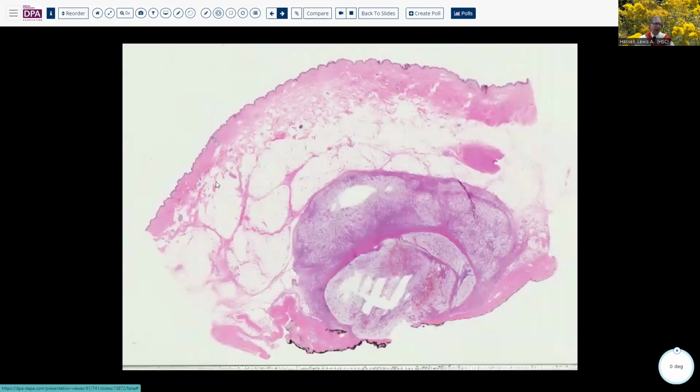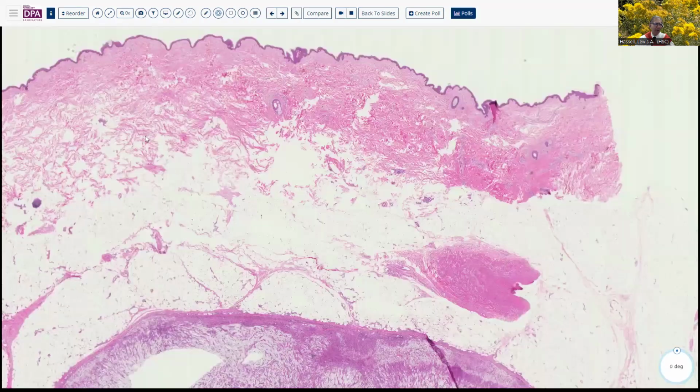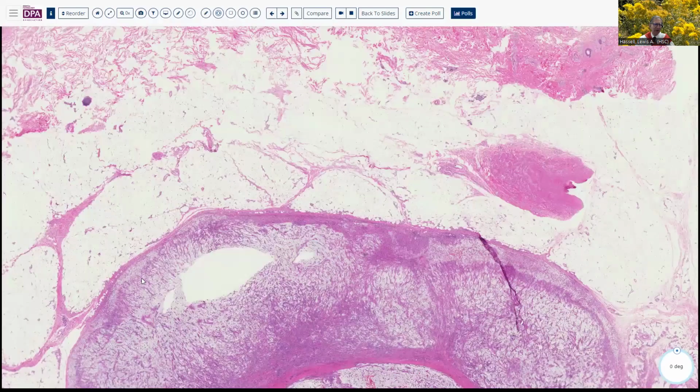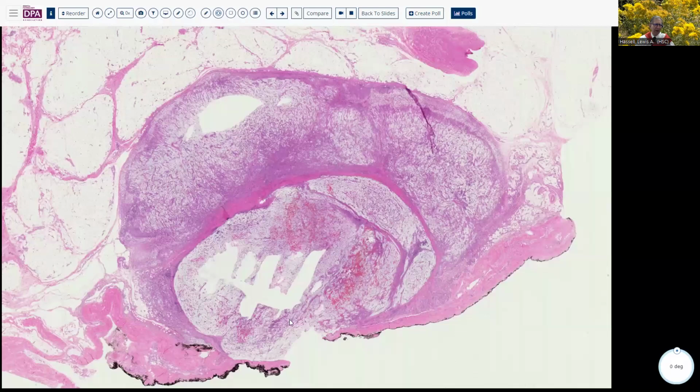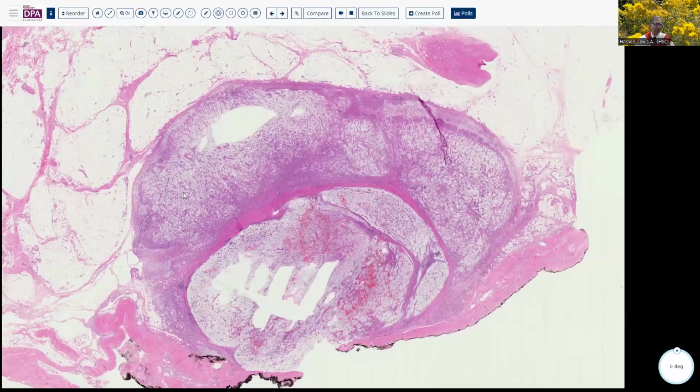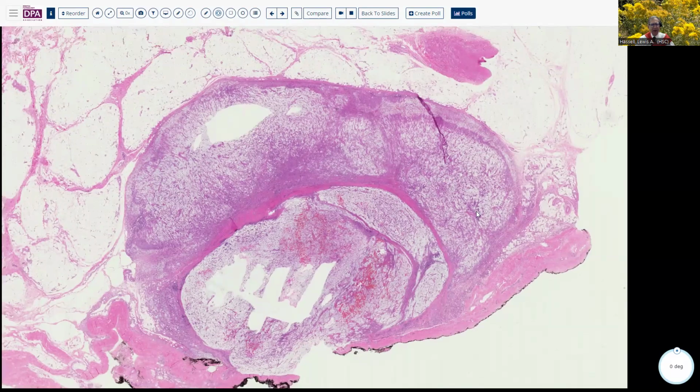Now, another lesion that presents in this category is this lesion. Here again, we can see the superficial surface, the skin up here. We have the dermis and then subcutaneous fat. And so this lesion is sitting right on the deep fascia. You can see that it's somewhat nodular, with this mixed pattern of edematous tissue, like nodular fasciitis again.